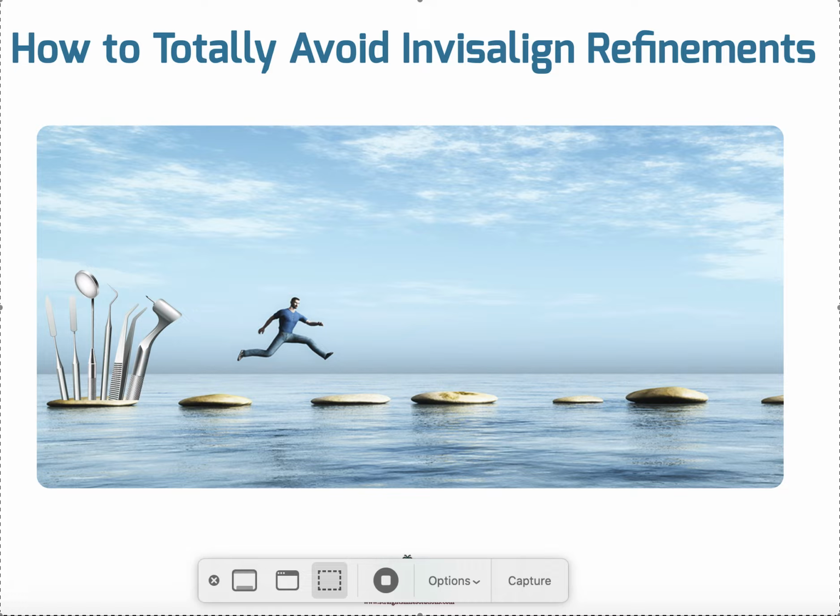If you don't want to deal with it, then pay the extra cost for dental monitoring system and let them deal with it, because their AI will run this if you have that much volume, but you're going to pay for it. You know, it's going to be expensive. But if you don't have a ton of patients, like hundreds, you might just create your own in-house or use GP ortho tracking or use Invisalign's virtual system, which is free as long as you opt into it and you're using it on Invisalign cases. It's very convenient. So yeah, these are my tricks and tips.